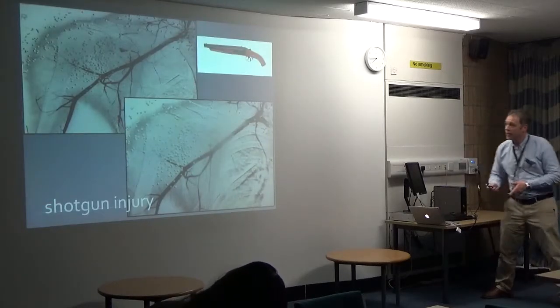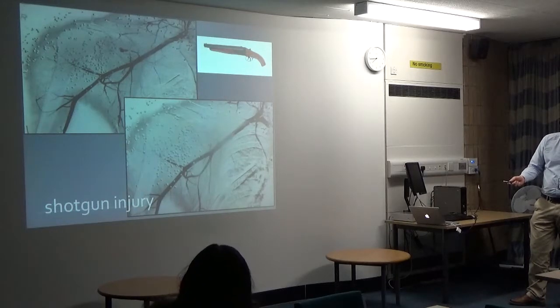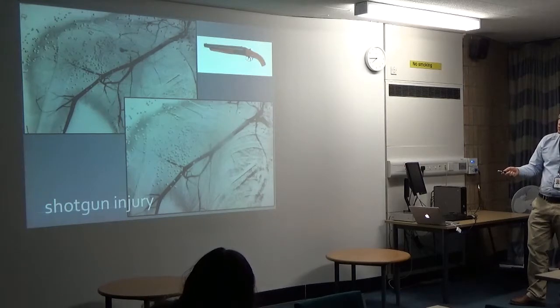So here's another trauma case, and I just show you this because it's a lovely picture, if you like that sort of thing, of somebody who's been shot in the shoulder. Can you see all these little pellets? They're all the pellets from the shotgun cartridge. You'll be getting your eyes in on angiograms now, so you'll be able to see what's going on. This is the artery coming down here, and all the branches of the artery, they're all normal. And this little splodge, it doesn't look very dramatic, but that'll be active bleeding like we saw on the last one with the patient who had a stab injury.